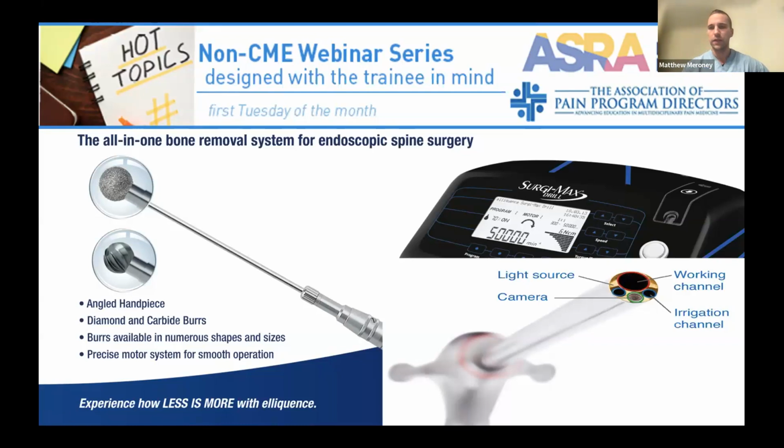There is a camera that frequently is angled at different degrees. I would say most commonly 30 degrees. There's the irrigation channel, which we use continuous irrigation, and there's a light source, obviously. And this, you can see the generator that powers the drill.